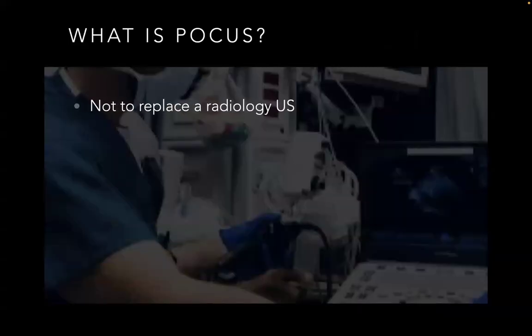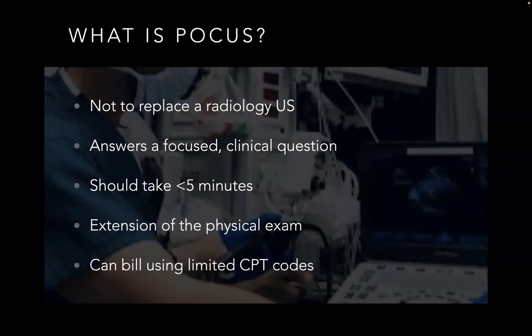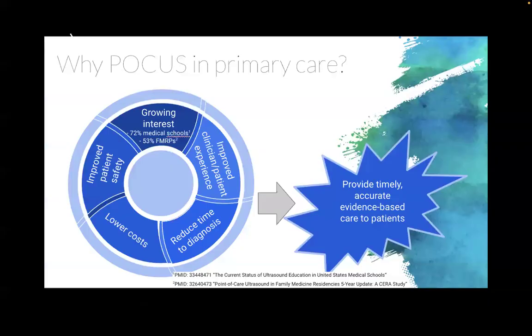So what is point of care ultrasound? This is not to replace radiology ultrasound. It's to answer focused clinical questions. Usually it takes only a few minutes. It's an extension of the physical exam, and you can bill these with limited CPT codes.